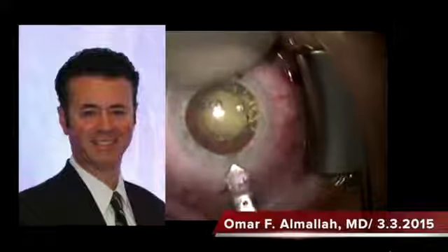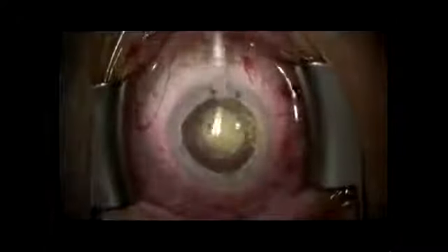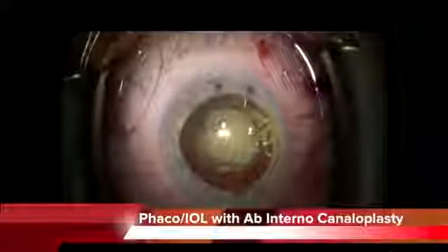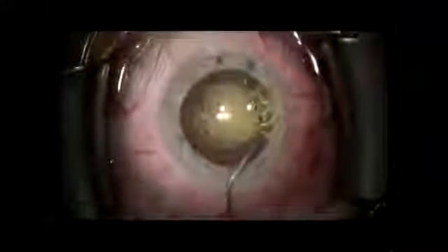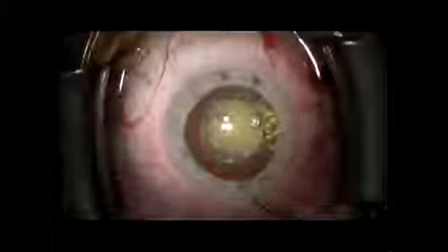I am Dr. Omar Almallah, an ophthalmologist in private practice in Toms River, New Jersey. In this video, I will demonstrate a new ab interno approach canaloplasty done in conjunction with femto laser cataract surgery. In this patient, the preoperative intraocular pressure with topical glaucoma medications is 26 millimeters mercury.